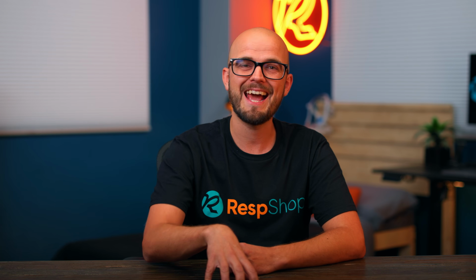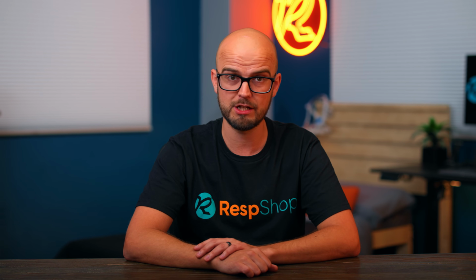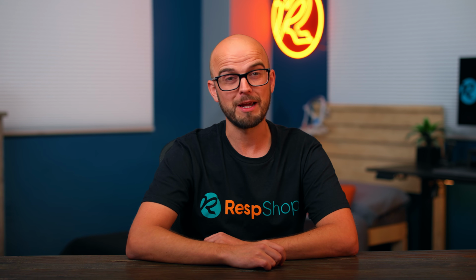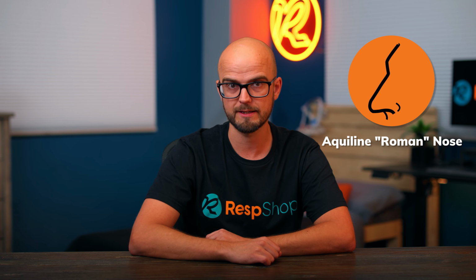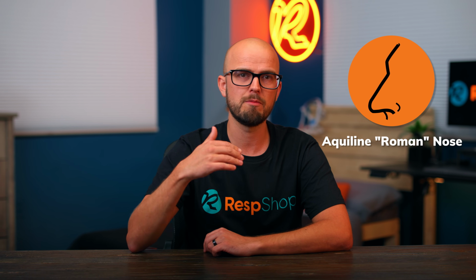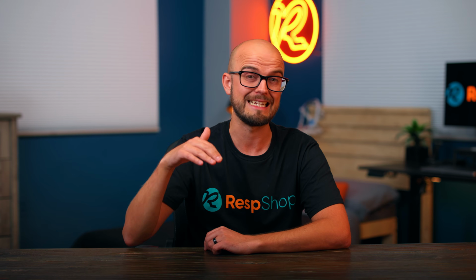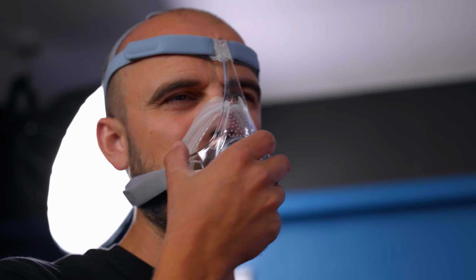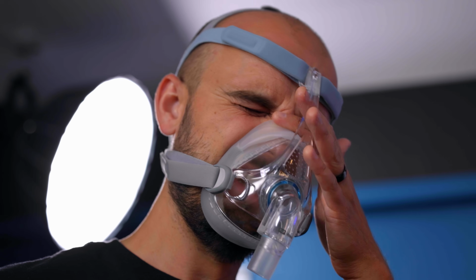So those are my hacks for hair and no hair related issues. Now let's talk about noses. One nose shape that can make masks uncomfortable and leaky are Aquiline or Roman noses. These are noses that have a strong bridge that curves or turns slightly downwards. The problems faced by people with this type of nose shape concern rubbing on the bridge or poor fit around the nose.